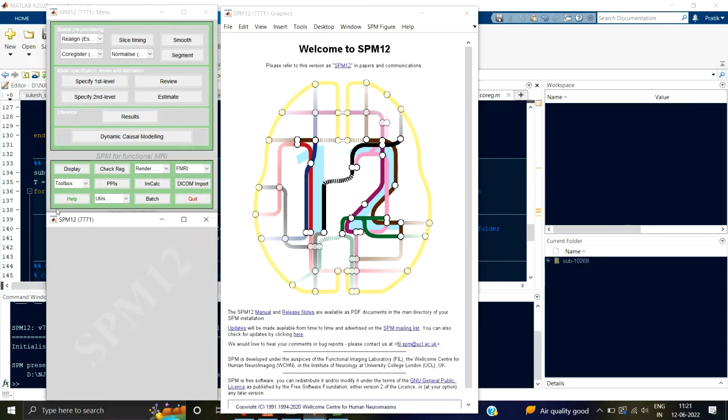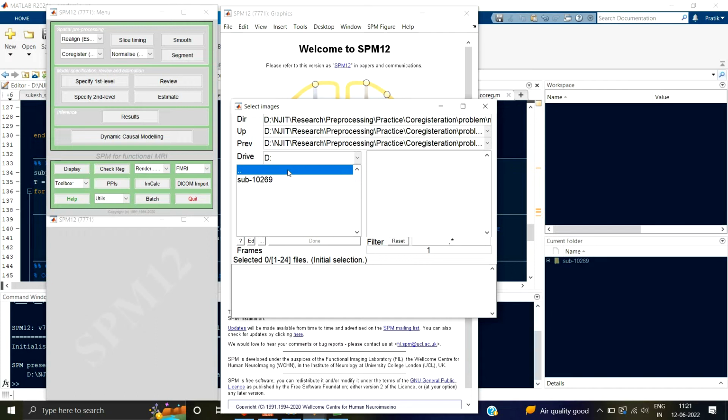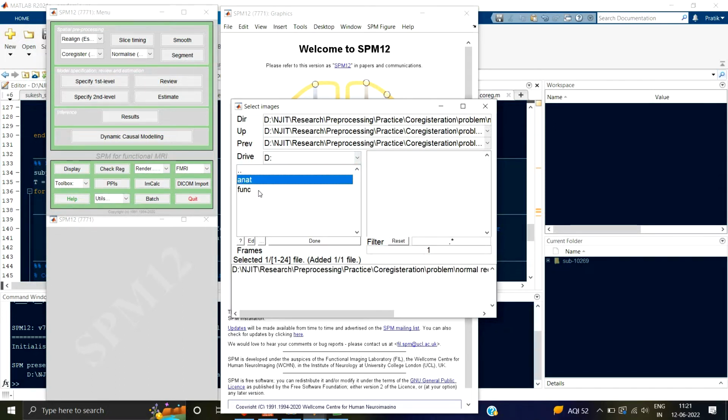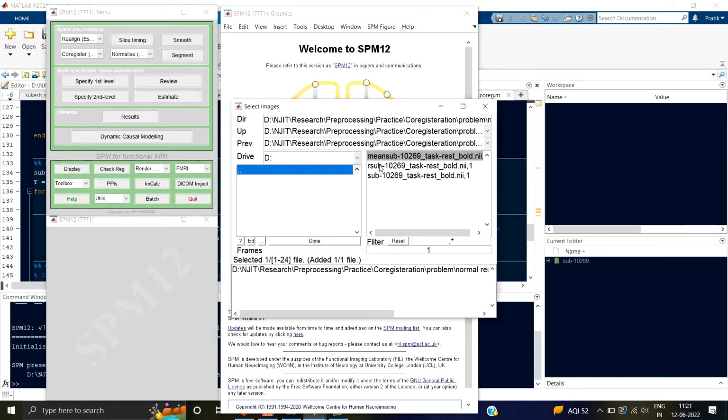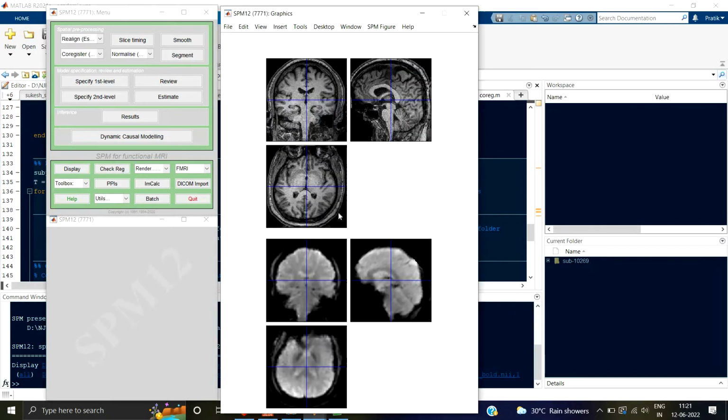So let's get started. First let me tell you what the problem is. I was just going through some of my pre-processing of some of the subjects, and I have done realignment at this stage, and I have also done co-registration. Now I am just checking the output after co-registration. First I'm checking the registration. I have inputted the anatomical image over here, and then I'm inputting the resting state realigned image. So this is the anatomical image and this is the realigned image.